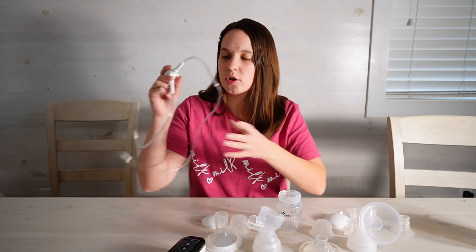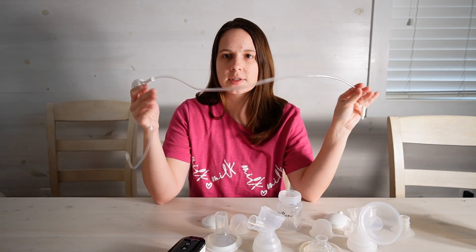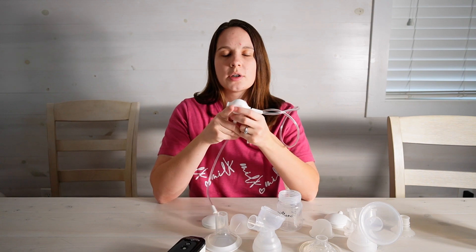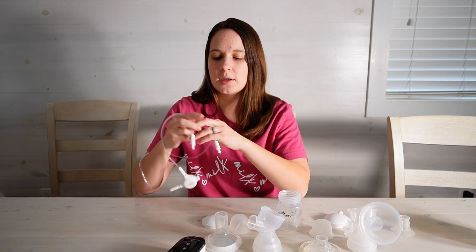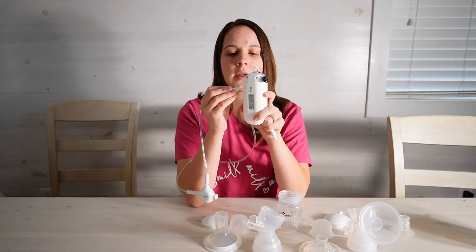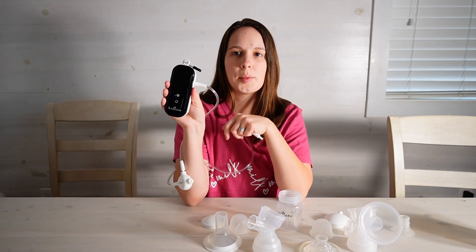In terms of tubing I'm setting it up for just single side pumping. If you were double pumping you just have the second tube over here, your short tube, and then of course that connects inside of your Baby Buddha pump.